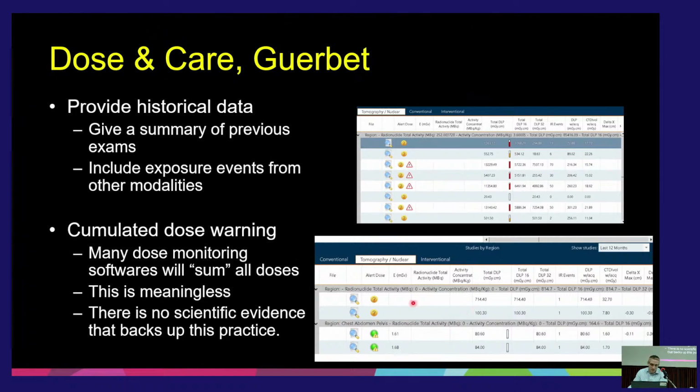But you can see here, well, you might not be able to read it, but these are actually PET images. It actually gives you the exposure, so the radionuclide activity. So not only am I getting the CT doses and stuff down here, but you can see this patient also had some nuke studies at some point. There would normally be some dates and times and stuff that I just cut off when I took the image.